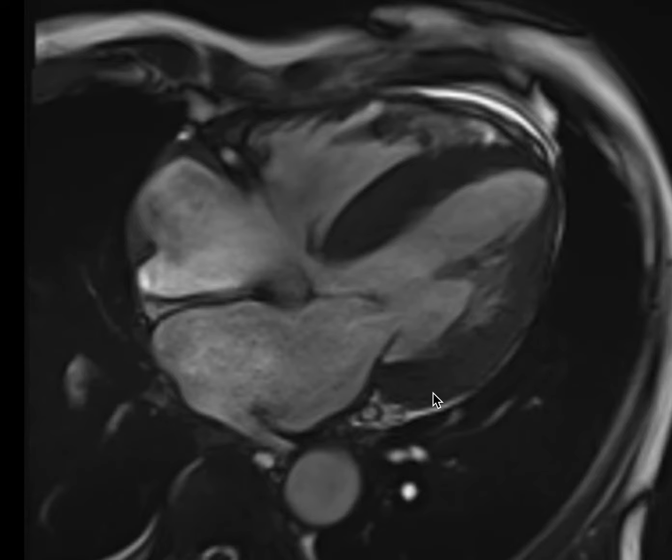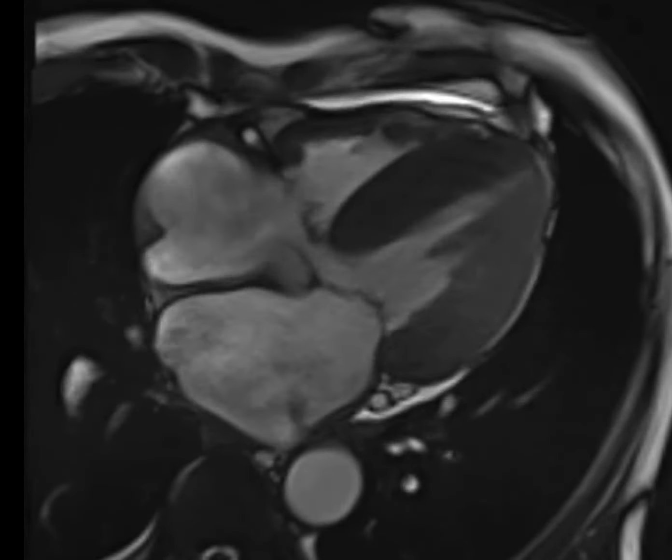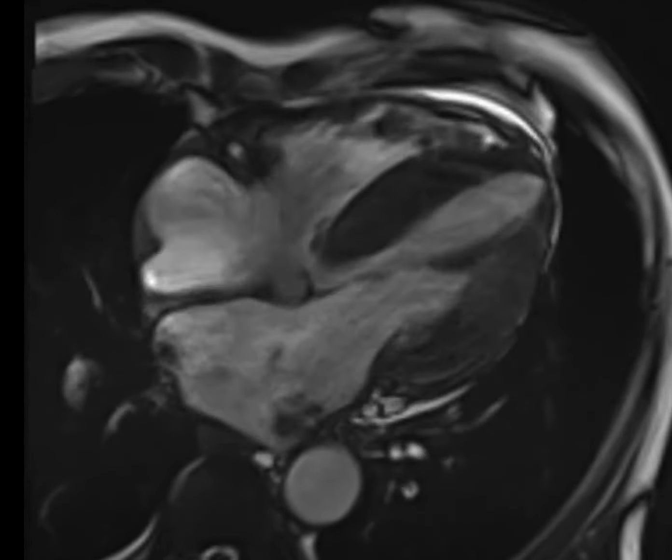Afternoon, everyone. As we mentioned earlier, the approach to cardiomyopathies is usually trying to divide the cases according to whether what you see is in the line of differential diagnosis of hypertrophic cardiomyopathy or dilated cardiomyopathies. As you may see here in this case, the left ventricle is hypertrophied, with a dilated left atrium, and more or less preserved function.